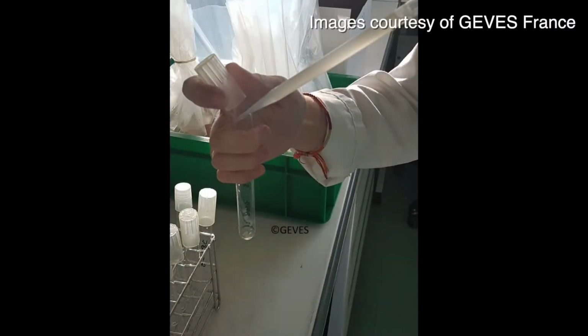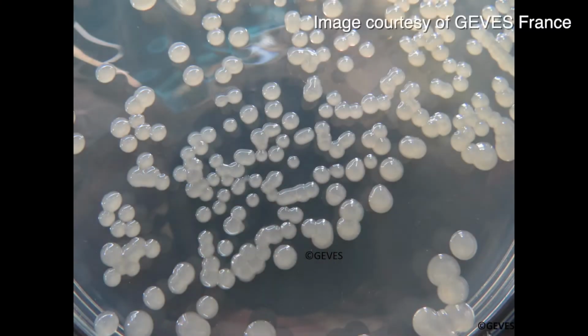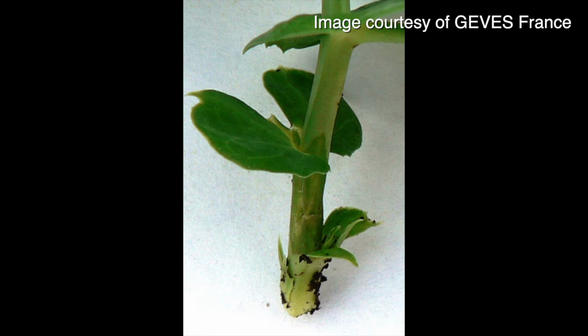So Pseudomonas on pea, we were doing quite a lot of testing. And we had a method in place for several years that had been also validated within ISHI previously, which involved isolating suspect isolates of Pseudomonas and then using a pathogenicity test on pea plants. Now that process was validated and was quite specific, so we were fairly sure that it would be a pathogen if it's positive in the pathogenicity test. The problem was that test took quite a long time. You needed also a lot of space to test all of the suspect isolates.